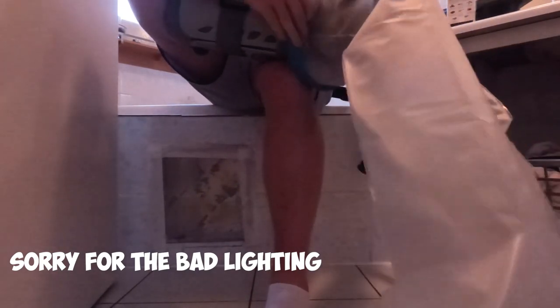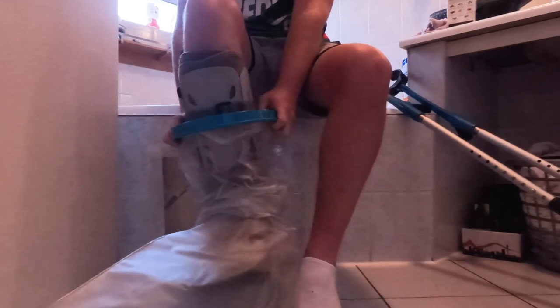Getting the sleeve on can be a bit tricky. Push the initial silicone over your boot, set aside your crutches, then slide it up all the way so it comes up over your boot. You can put it as high as you want.